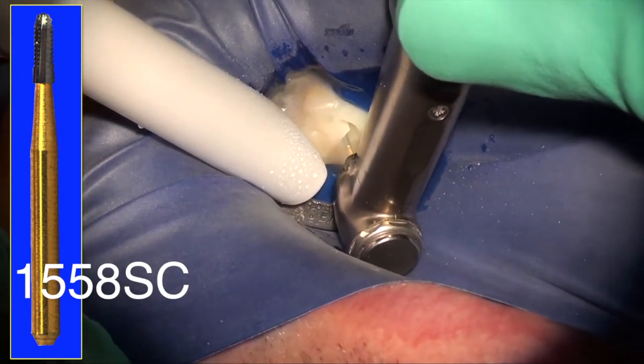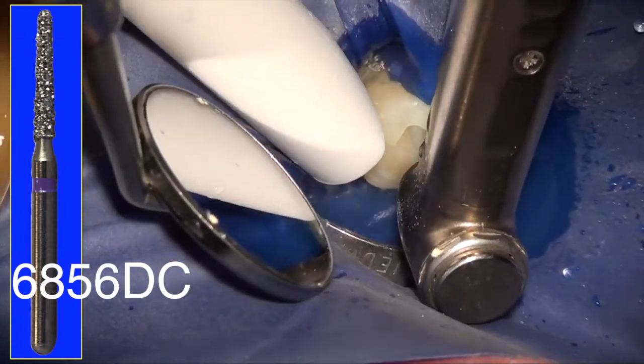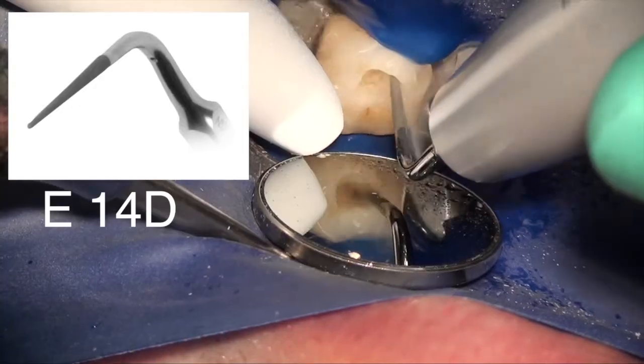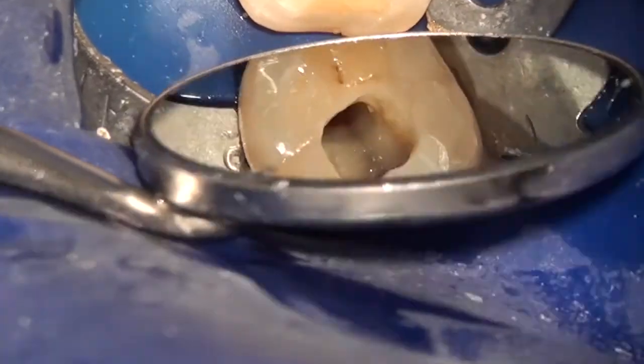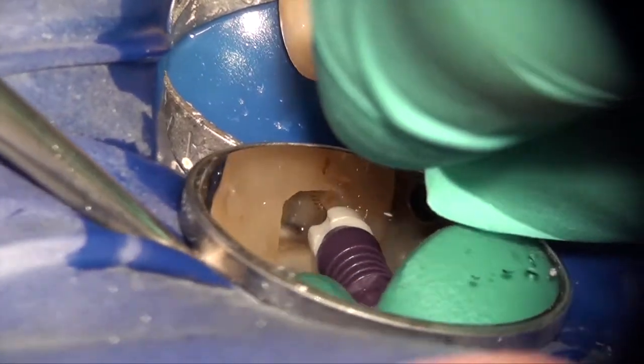Then I use a saber cut, the 1558 saber cut, followed by a Dura cut or another diamond that you would prefer, to just get some nice flow in the chamber, and then a round burr to kind of mark the points, and then using the ultrasonic here to just blend everything in. As you can see, very quickly we've created an access that is fairly conservative and flows in.